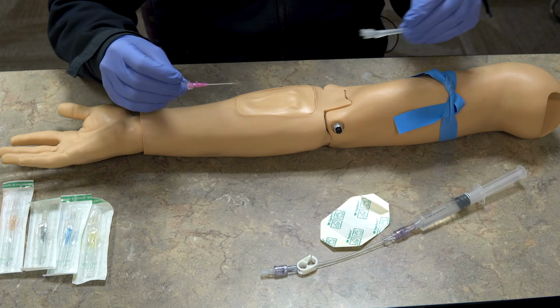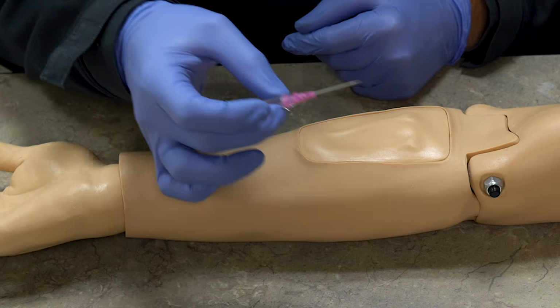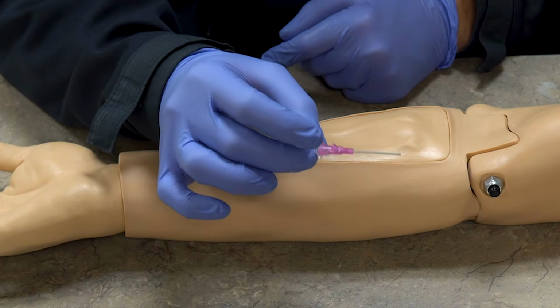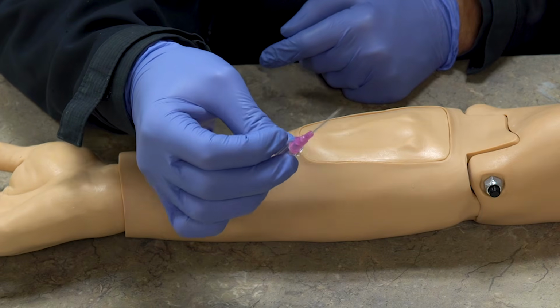I'm gonna pull it out of the safety cap here, and always explain to the patient what you're doing. This is painful, it's scary, a lot of people don't like it. And you hold an IV catheter with your thumb and your middle finger, and then your other finger is resting on top of it there, and that provides a lot of control of where the catheter goes.